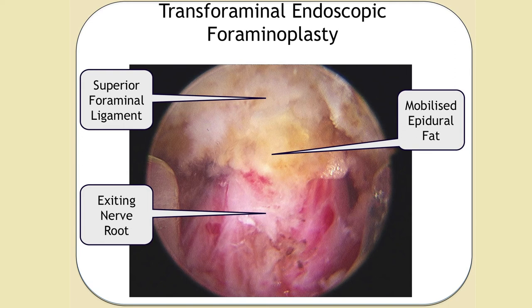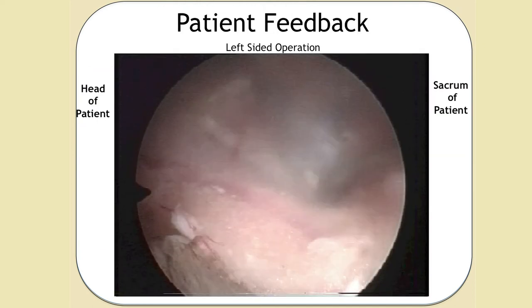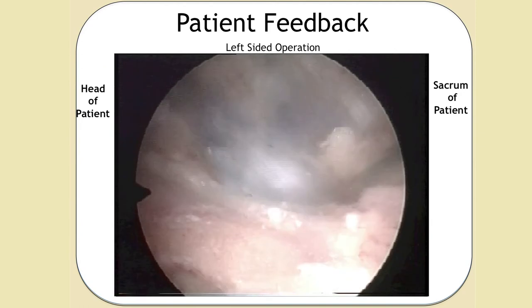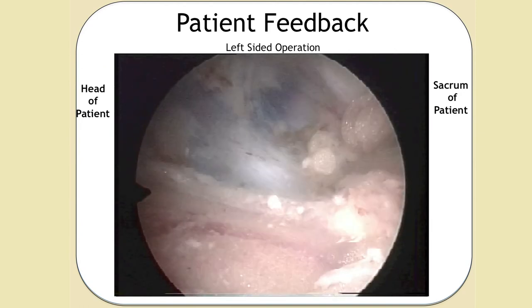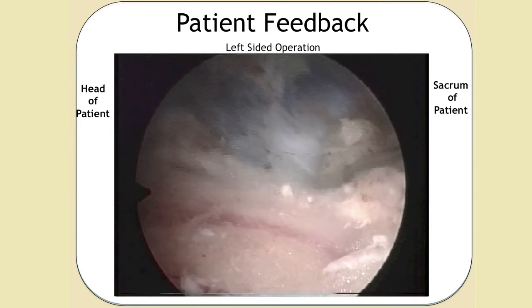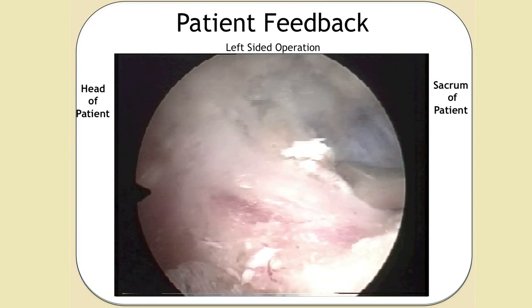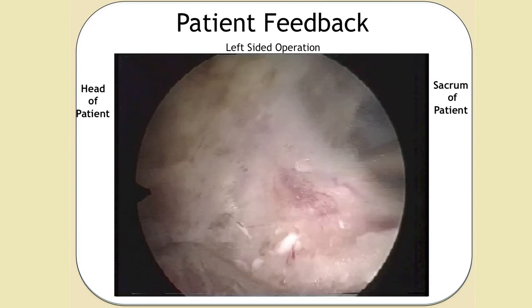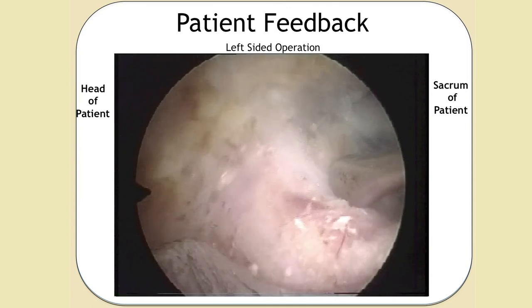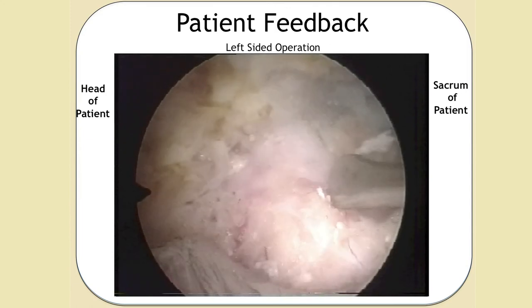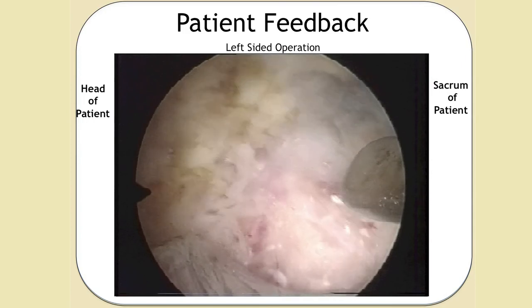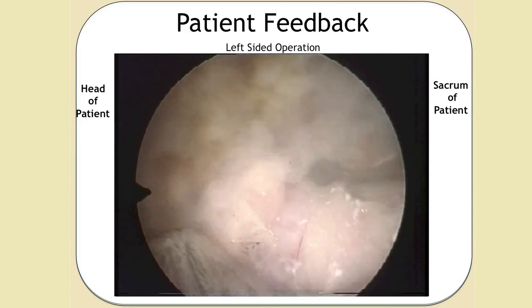Here is the nerve running across with its little vessel on top. After clearing away the scarring, here's the superior foraminal ligament. What this shows is that the disc — which we've stained blue — is very soft and protruding, and that the nerve was adherent to that billowing disc. If you leave it like that, you're going to have ongoing symptoms.